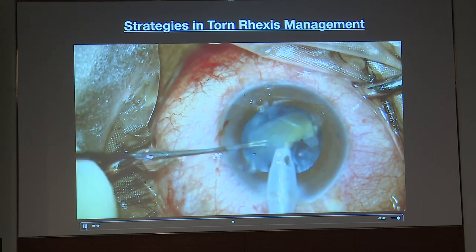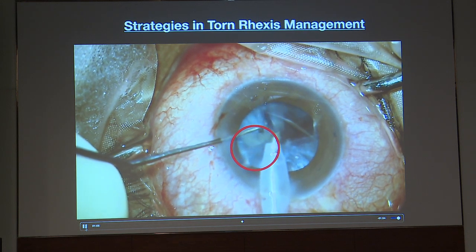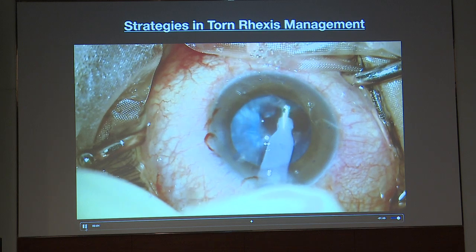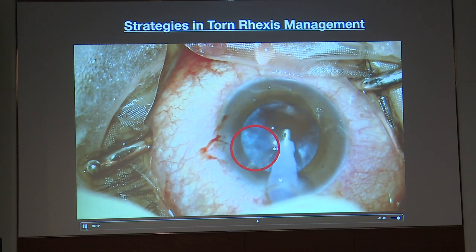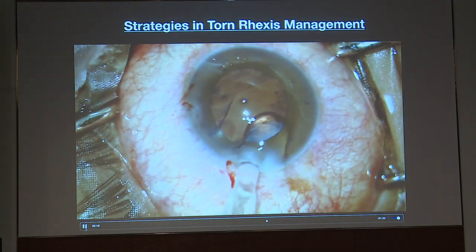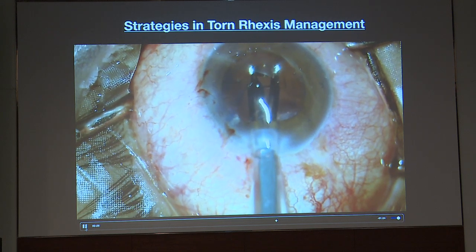The last nuclear piece was eaten and nuclear emulsification was completed with continuous vigil on the everted nature of the flap. Cortical aspiration was done with lower vacuum, with the fluttering of the flap tear kept in my visual horizon. I confidently implanted the IOL in the bag as I knew the posterior capsule was intact because of the flap motility sign in my armamentarium.